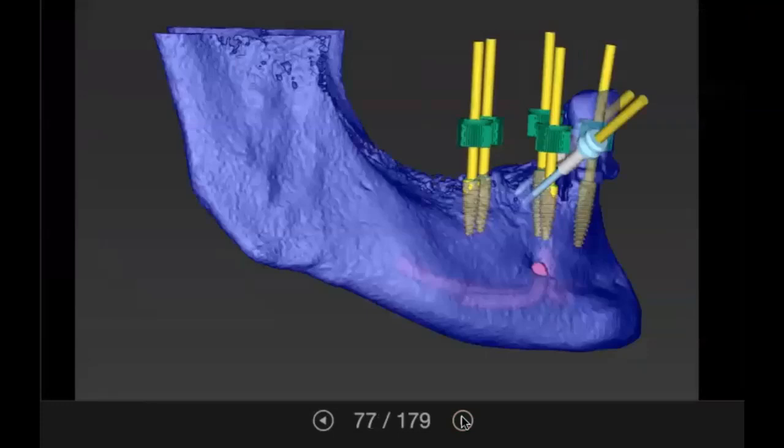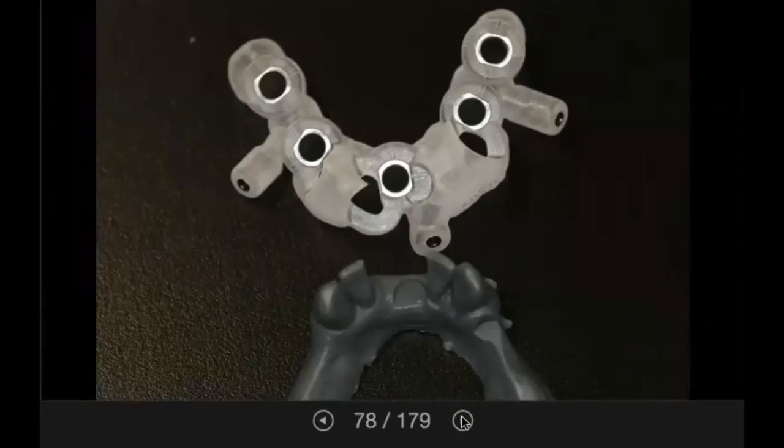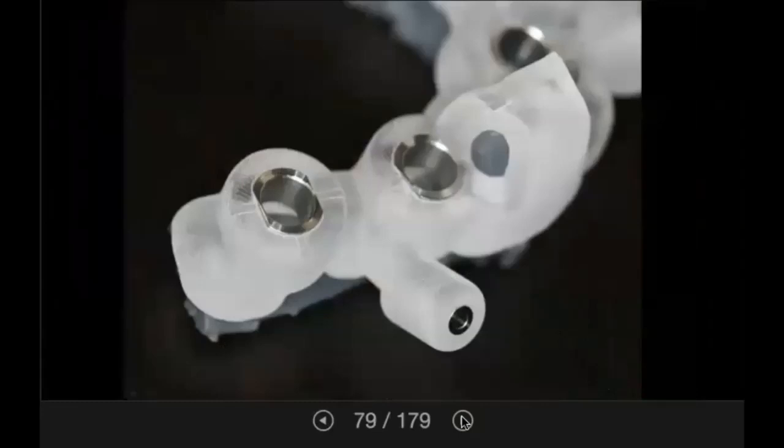All posterior implants are perfectly parallel. Due to the angulation of the anterior mandibular buccal plate, the most anterior implant is slightly angled forward. In this case, total implant divergence is less than 10 degrees. A custom guide is fabricated to be a partial tooth supported, partial soft tissue supported guide. Skeletal fixation pins are planned to allow for greater guide stability and implant placement accuracy.